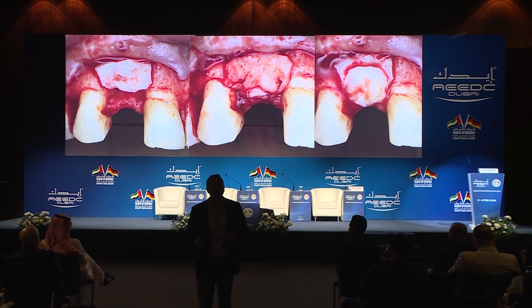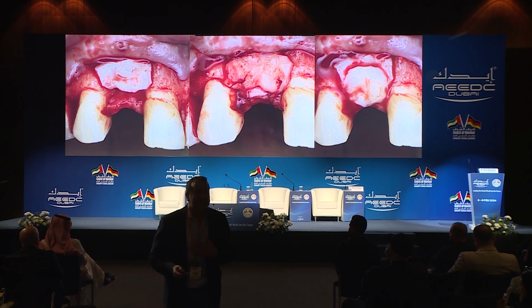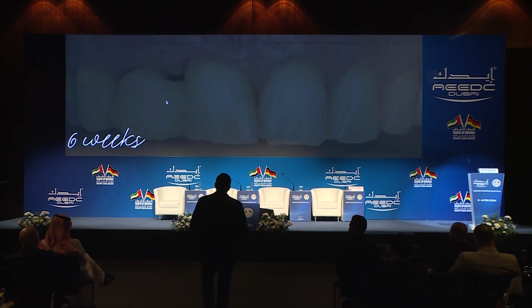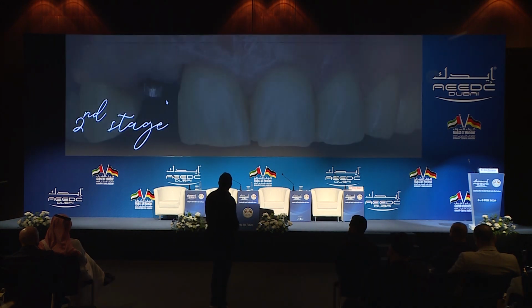I have cases where I did 3 surgeries trying to graft the papilla. Papilla is my thesis. I did my thesis on papilla. And it's not predictable surgically to graft papillas. And this is 6 weeks post-op.